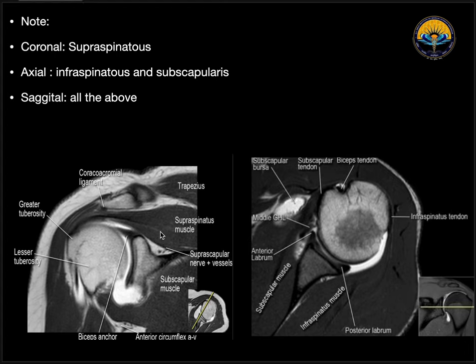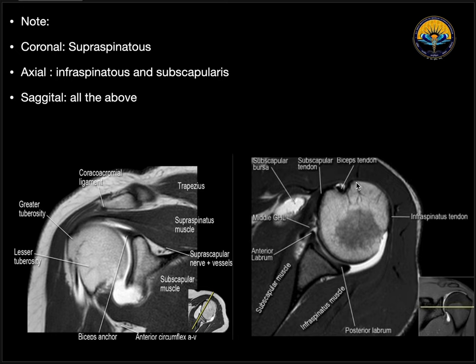On the coronal section, below the acromioclavicular joint, we will have supraspinatus going and inserting on the greater tuberosity. On this axial section, we can see the humerus, the scapula, the glenoid cavity, and we can see the subscapularis muscle anterior to the scapula. We can see the subscapularis tendon and its insertion on the lesser tuberosity. Posterior to the scapula, we can see the infraspinatus muscle, its tendon, and its insertion on the greater tuberosity. Between the greater and lesser tuberosity, we can see the bicipital groove, and in this groove, we can see the long head of the biceps tendon with the transverse humeral ligament above it.